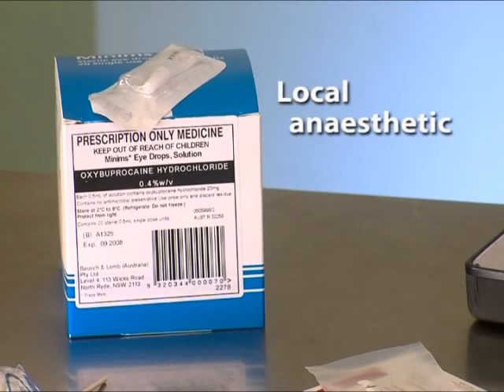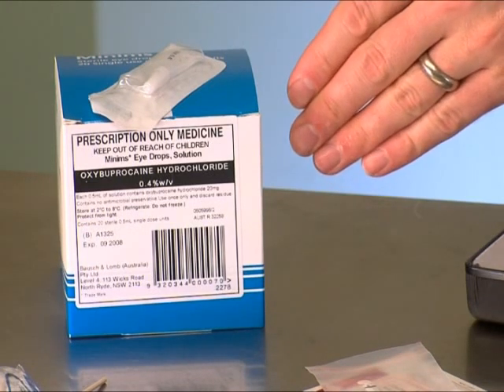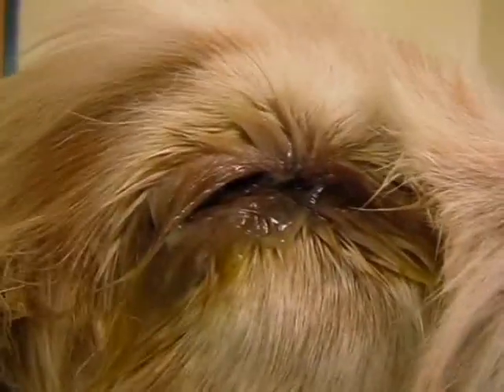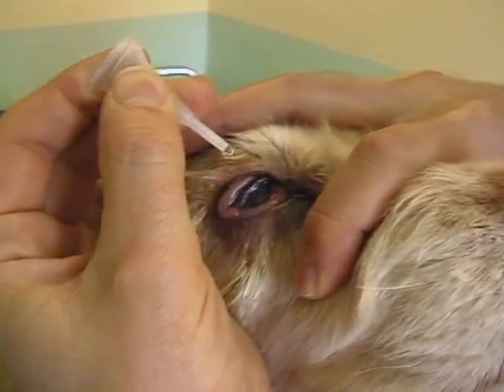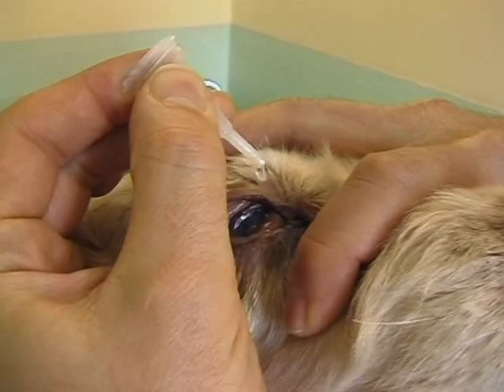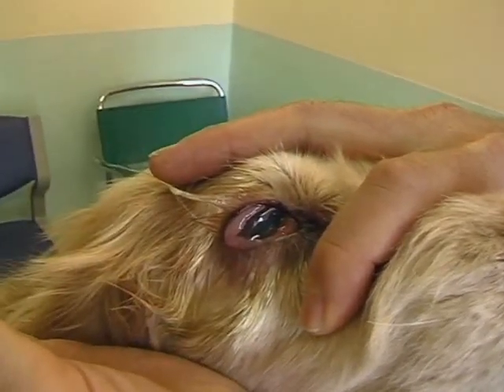Local anaesthetic drops have various applications, including examination of a painful eye. Particularly if there's a nasty ulcer, to facilitate examination, using a local anaesthetic will allow you to open the lids and make the animal more comfortable, to hopefully get the third eyelid out of the way and let you see what's going on.